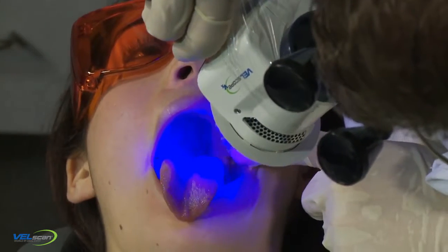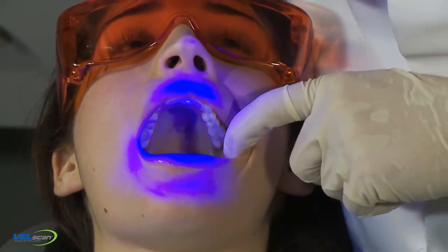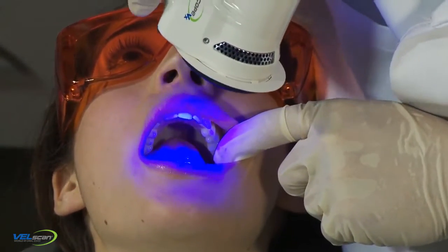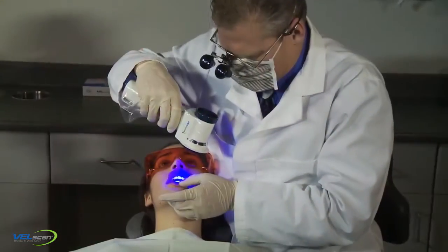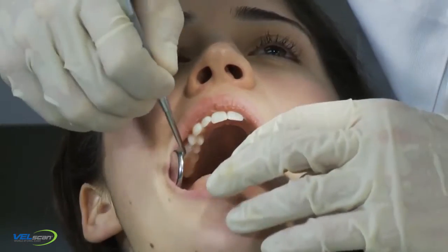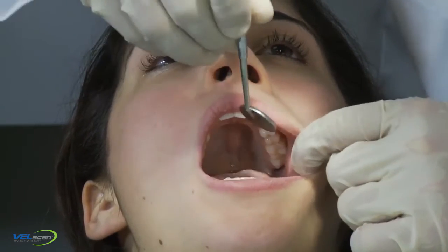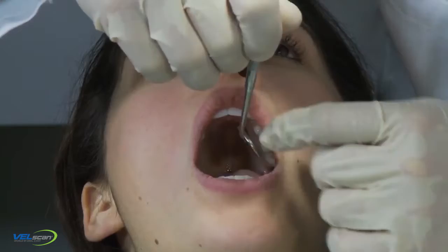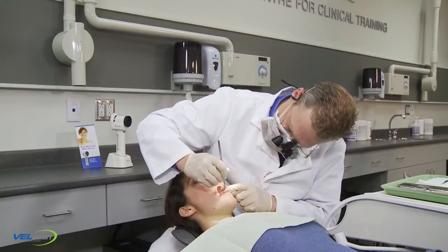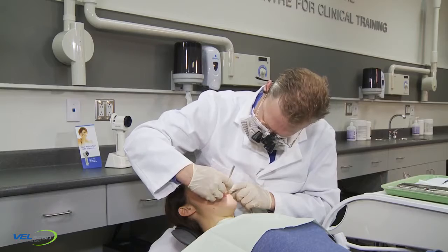If a suspicious area cannot be ruled out as a normal variant or otherwise benign, a follow-up visit for re-evaluation should be scheduled in approximately 2 weeks. The dentist should remove all potential etiological contributors in the area, such as trauma or infection. The intervention could be as simple as relieving a pressure point under a denture base, recontouring a sharp cusp, or treating for oral candidiasis. If the lesion has not resolved after the follow-up time, proceed with further investigation of the suspicious tissue according to your regular protocol.